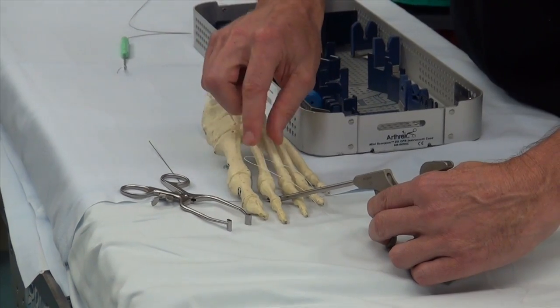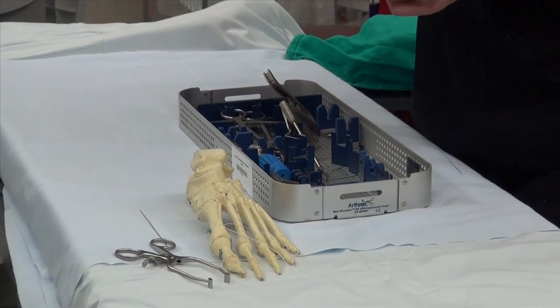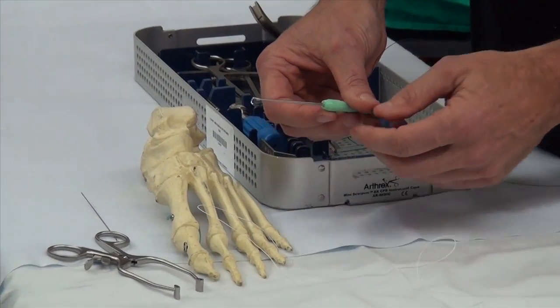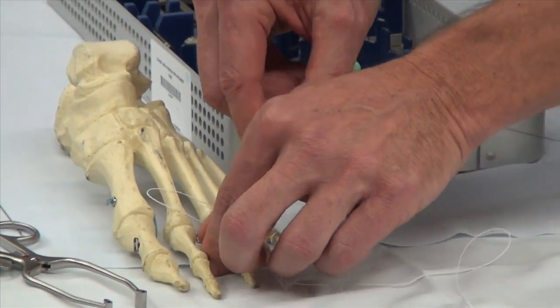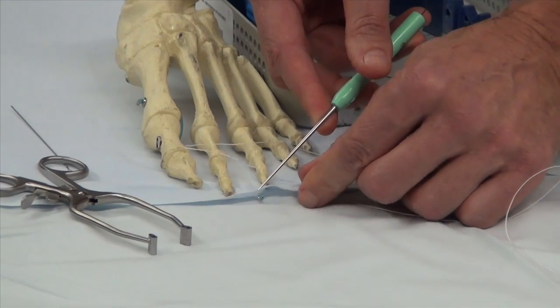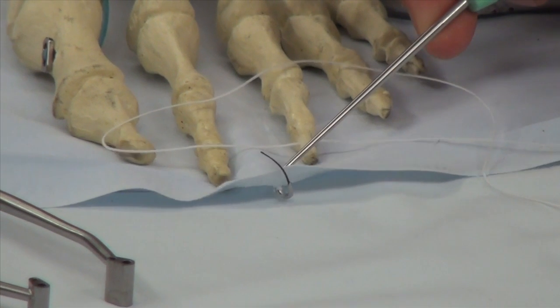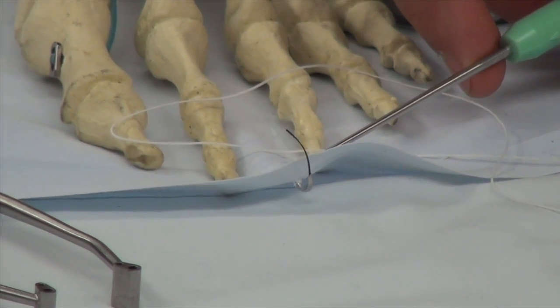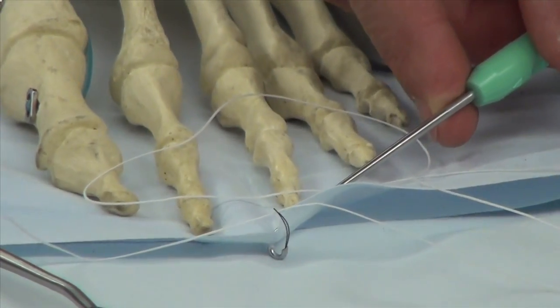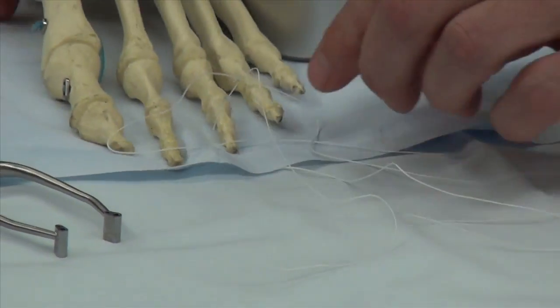If you don't want to use the Scorpion, you can use the pigtail device. The pigtail device is pretty cool because it's a simple all-in-one sharp tip. Pretend this is a plate — you pass it through and once through the plate, pull it upward, then pass the nitinol loop open. With that in place, take the suture and pass it through, pull the nitinol loop down, reverse it, and we're through the plantar plate.